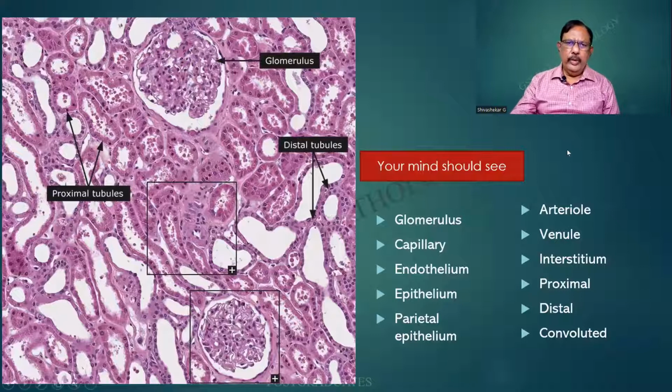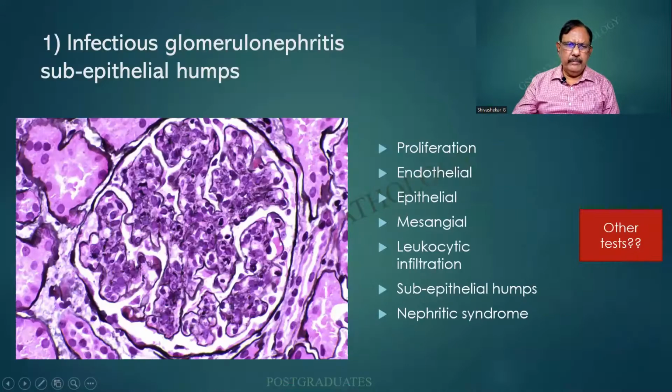So look at it over here. I am finding the glomerulus and the various tubules. I hope you are able to identify these elements.